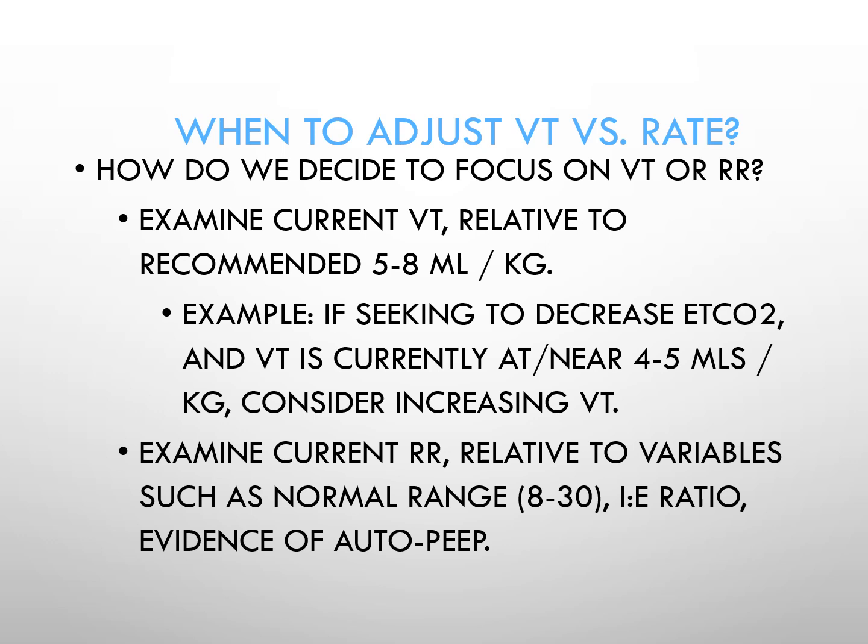Well, if my tidal volume is already pinned up at 500 or 550, so I'm at 8 or maybe even a little north of 8 mLs per kg, perhaps my ventilatory pressures are fine, but I'm still pushing the flight envelope when it comes to the high end of normal for my tidal volume. Then you're going to probably examine the respiratory rate. If you need to correct for a respiratory acidosis and your tidal volume is pinned up at the northern end or maybe slightly exceeding that 8 mLs per kg, but your respiratory rate is maybe only 14 or 16, actually look to work the respiratory rate.